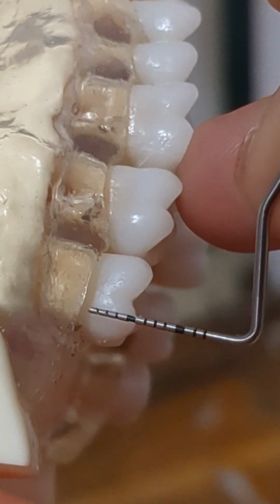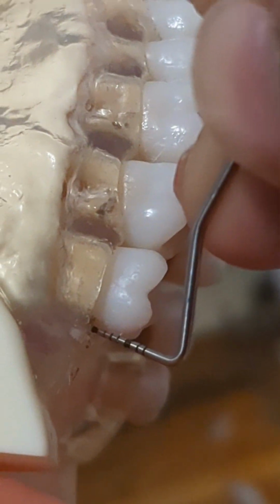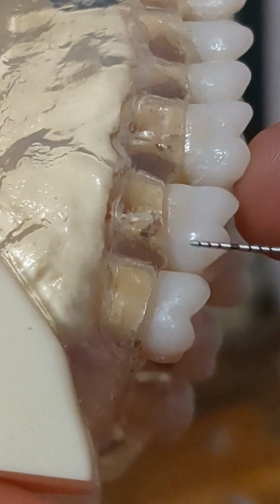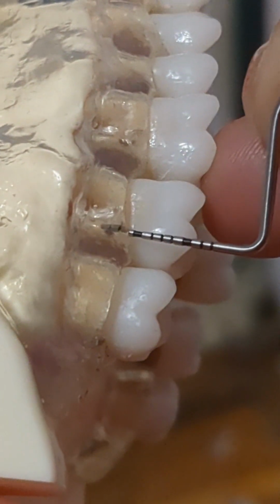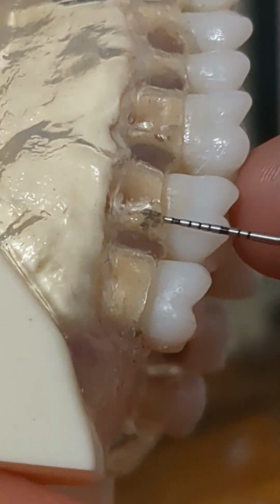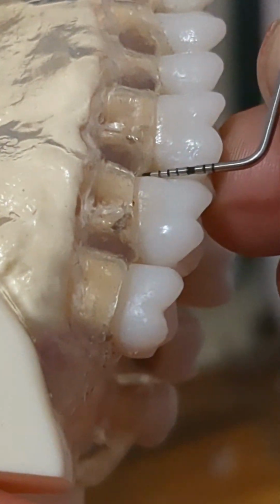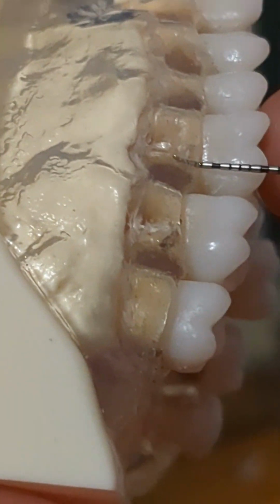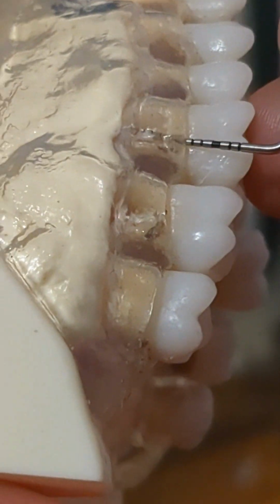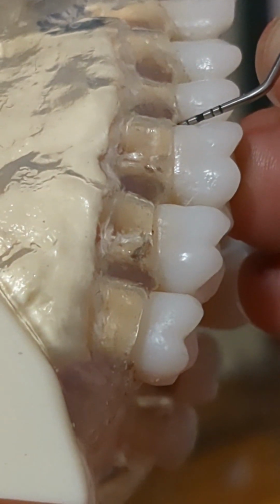Okay, let's begin probing quadrant number 1, tooth number 1, buccal surface, starting at the distal line angle. Turning in, we have a 5, walking back. Seems like we're having a 6, and this is a 7. Yeah, a little bit of calculus in the way. Rotating, got a number 8, walking back. Rotating, so we have a 4 and then a 5. A 6, walking back. Seems to be about an 8. Rotate in. That is definitely a 7.